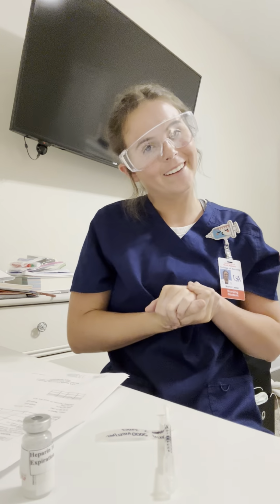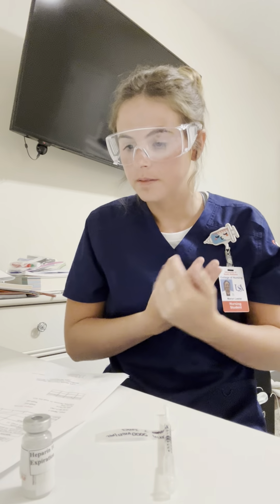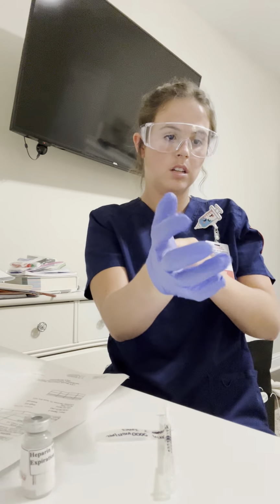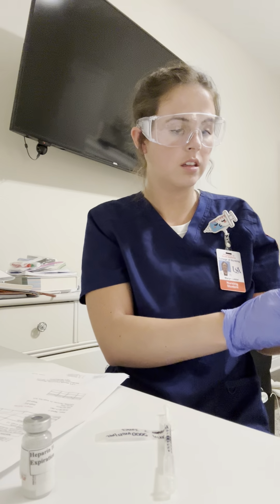So now I'm going to the patient's room. I'm going to knock. Hi, my name is Maryn. Today I'm going to be your student nurse, and today I'm going to be giving you heparin. Do you have any questions? No? Okay. So now I'm going to start. I'm going to wash my hands, and I'm going to put on my gloves.